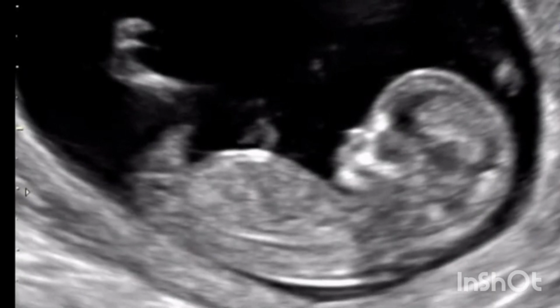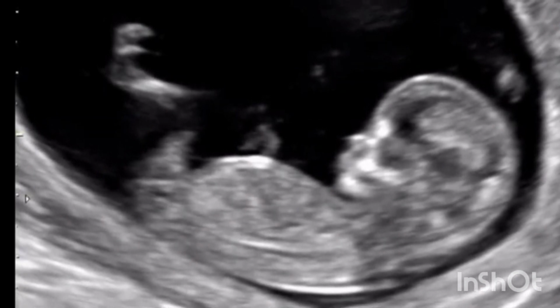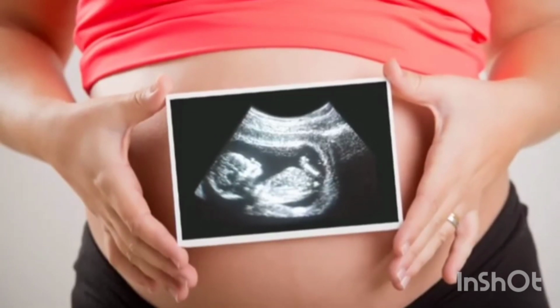Most parents today will want to find out the sex of their baby before birth. One of the most common ways to do this is with an ultrasound, most frequently performed at between 18 and 20 weeks, and even above 20 weeks. You can find out the sex of your baby during a scan that is performed to check that your baby is healthy.